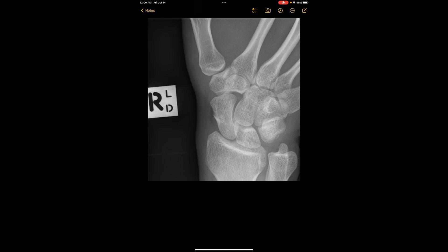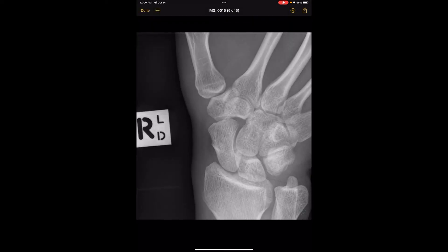Sometimes providers will order a four-view wrist. A three-view wrist is usually composed of the PA, oblique, and lateral. Sometimes people just order a two-view wrist, which would be a PA and a lateral. And then some people order a four-view, and this is what the fourth view usually is.